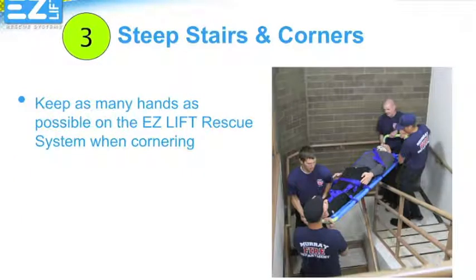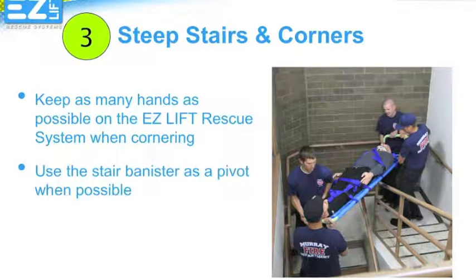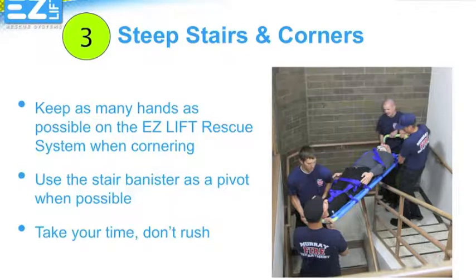During the stair carry, you will often have to deal with obstacles like turns. In these cases, keep as many hands as possible on the EasyLift Rescue System during the turn, using the oversized handle grips to ensure your safety and the safety of your patient. If possible, use the stair rail or banister as a pivot point to take the load while turning. Take your time in these situations — rushing a turn is always a bad idea.